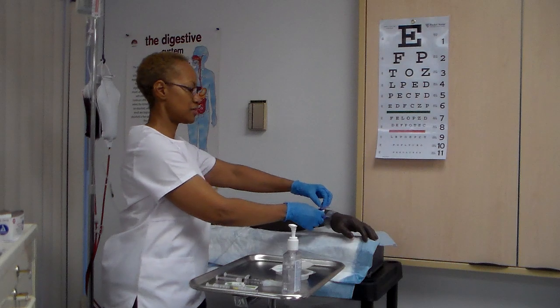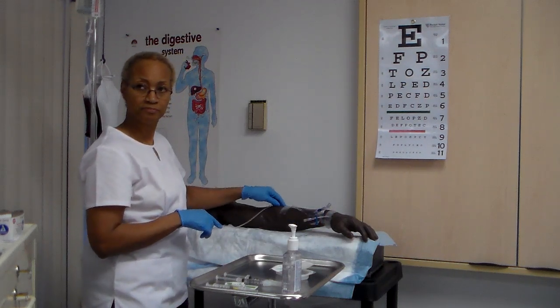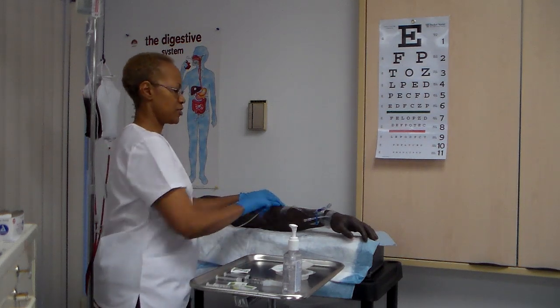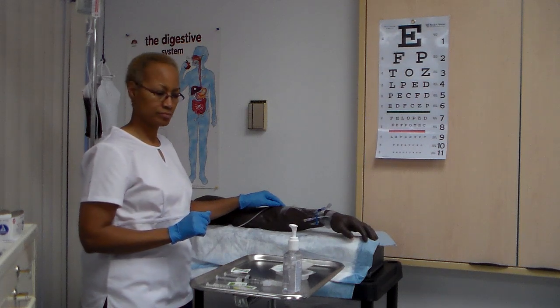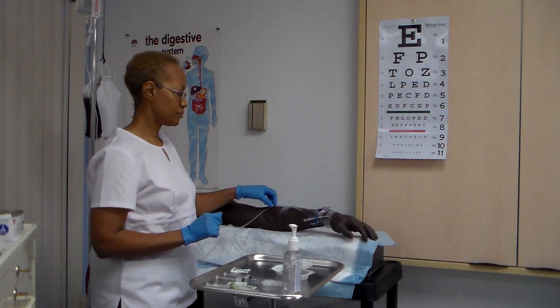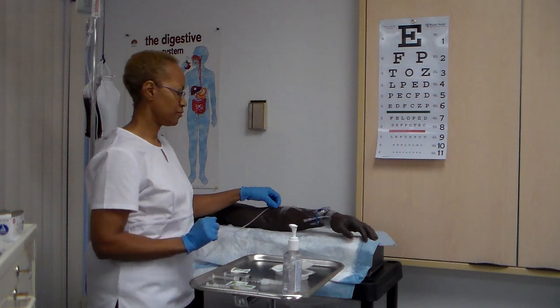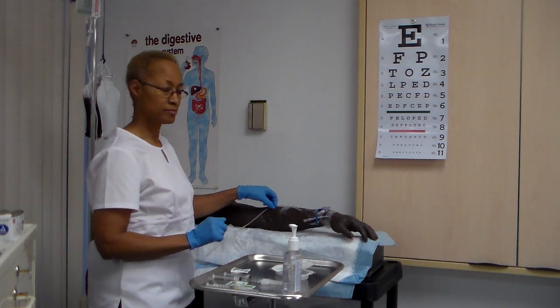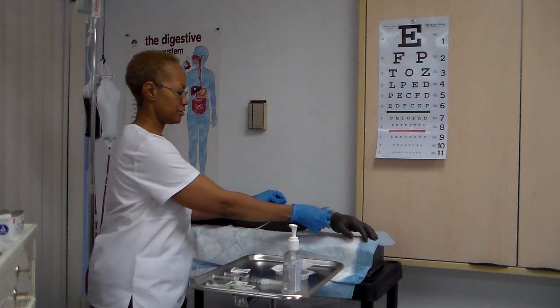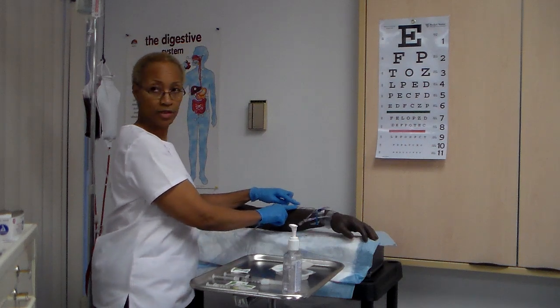Just going to put this here right now because I'm actually going to be giving it through a heparin line. But as she talks, I'm going to show you, okay? Clean off injection port with antiseptic swab. Allow to dry. Connect syringe to IV line. That's my syringe here. Insert needleless tip or small gauge needle of syringe containing prepared drug through center of injection port. Okay. Occlude IV line by pinching tubing just above injection port. So you would pinch back here, okay, as you're giving your medication through your port.